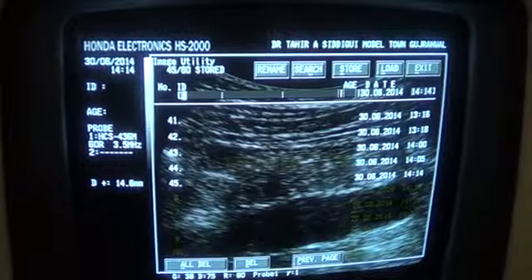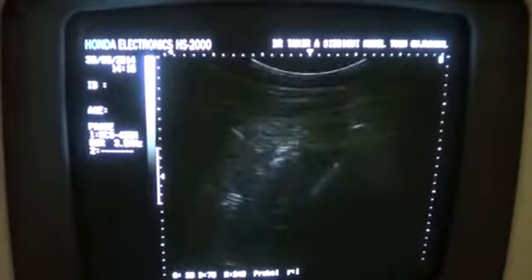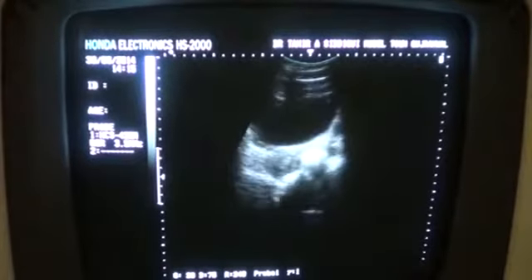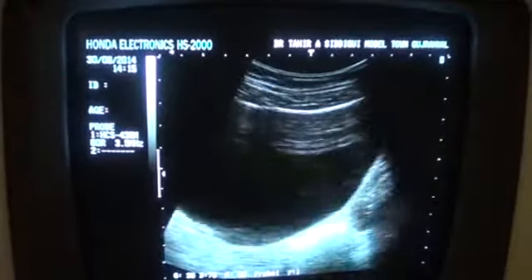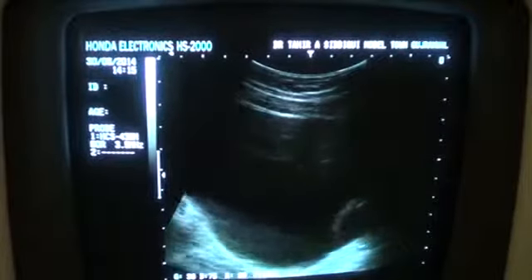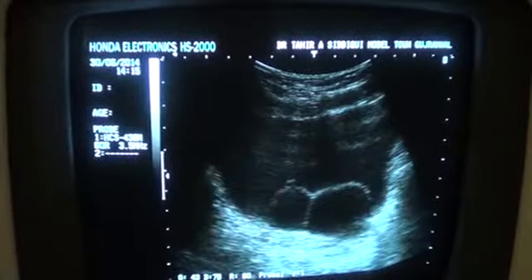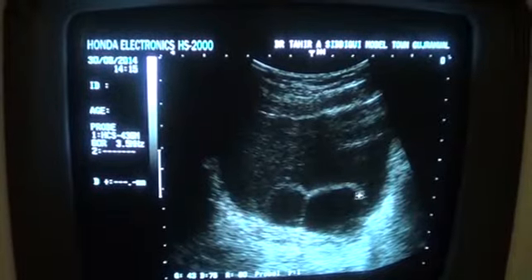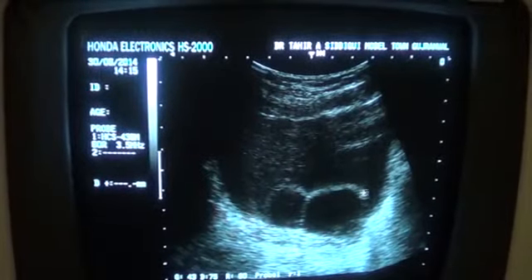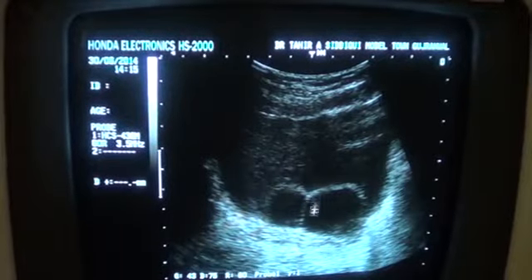Now why we are seeing all this is because of a very rare pathology that will be in front of you. Just wait. Now this is the area, ureterocele, that we call it. You see, we see a well demarcated thin wall cystic area, and another one alongside.